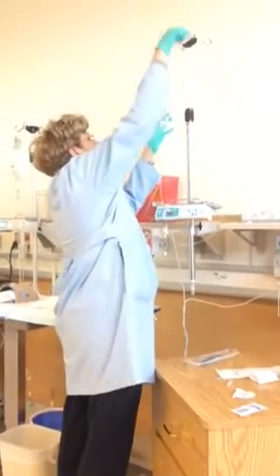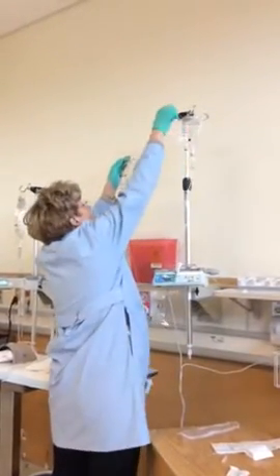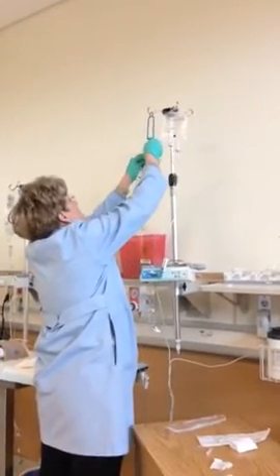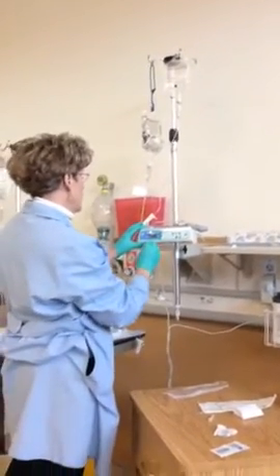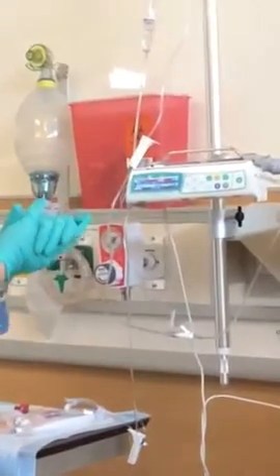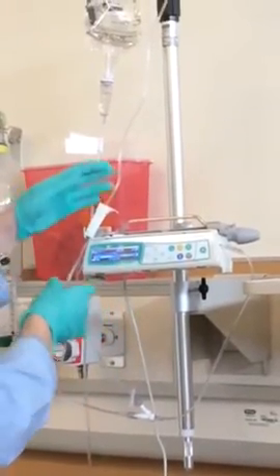Just like before, it's going to hang up high. I'm going to use my hanger. I need to drop my saline back. It's now hooked below the level of my piggyback. Right now this is clamped, so this is still dripping. So now I'm going to get ready to program in for my piggyback. So I'm going to push stop. And right now my screen does say change to piggy. I don't have to go to special functions. Arrow up, arrow left. Here's my piggyback.